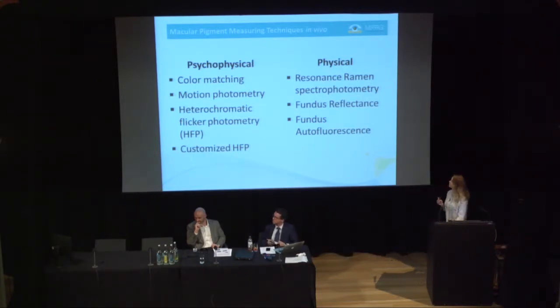Physical methods require minimum subject input. Some people call them optical methods, or sometimes objective, but we like to call them physical methods. There's resonance Raman spectroscopy, fundus reflectometry, and fundus autofluorescence. And I'm going to be discussing some of these techniques with you today.